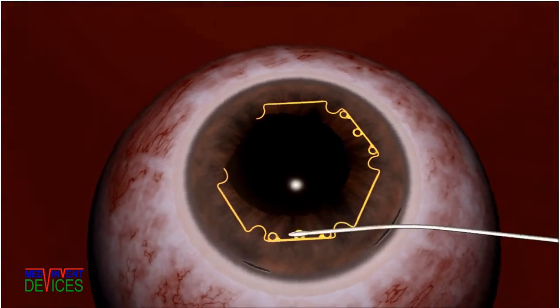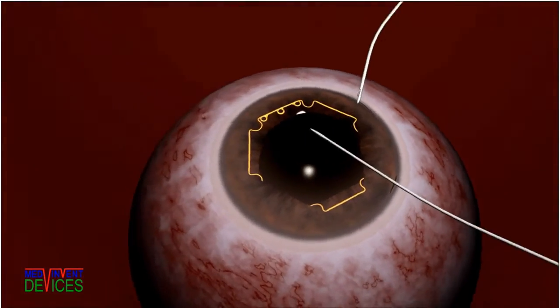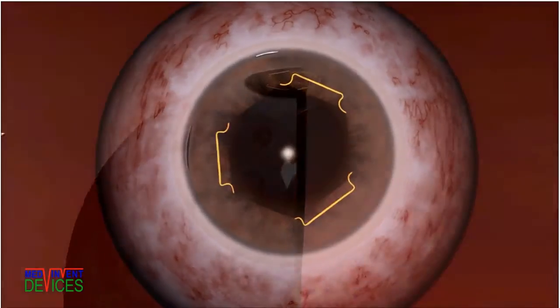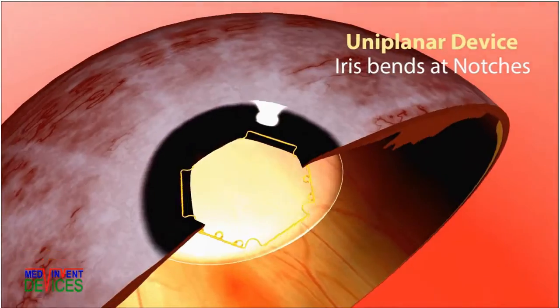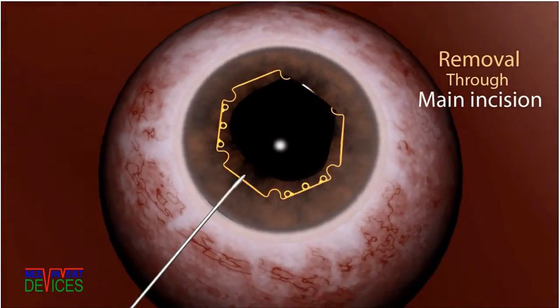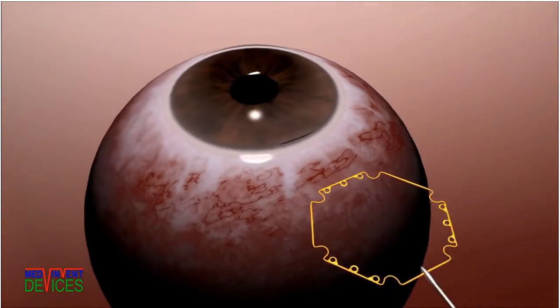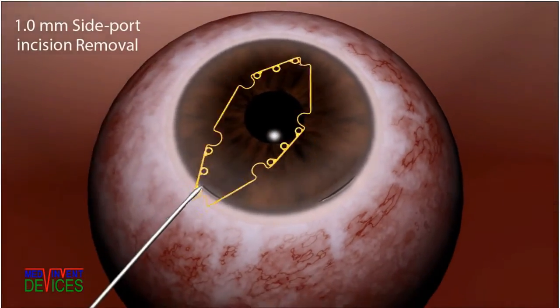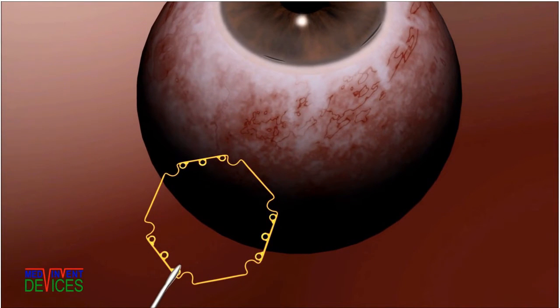As alternate flanges are tucked under the iris, the pupil expands. The iris bends at the notches while the BHEX remains in a single plane. Notches are disengaged and the device is removed through the main incision. In fact, the BHEX can exit through a 1 mm side port incision, which no other device can.